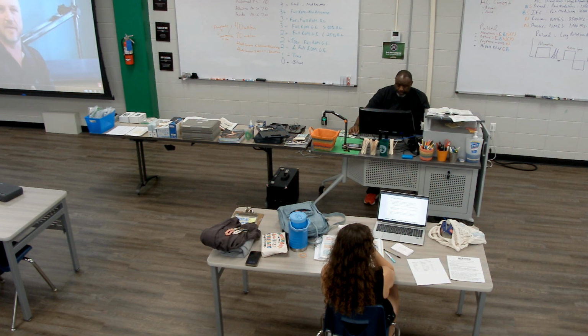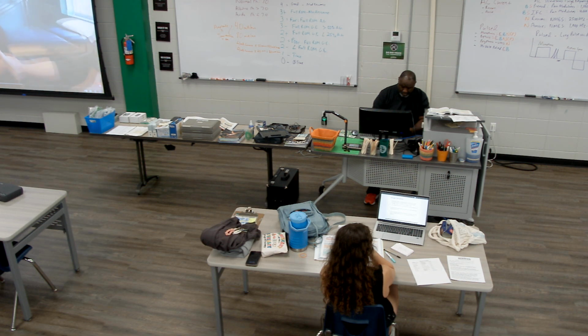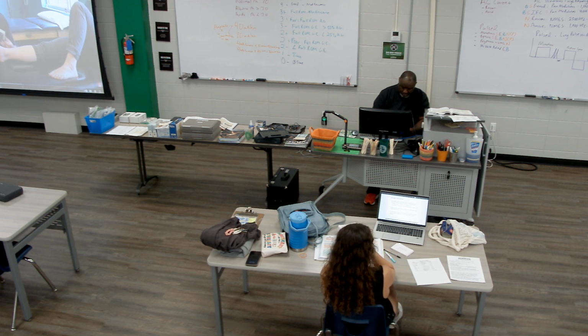All right, so here today we're talking about iontophoresis, and basically what iontophoresis is to help reduce inflammation and pain. It also helps with major diagnoses that we see here in biomechanical therapy, such as fasciitis, bursitis, tendonitis. It also helps with osteoarthritis and rheumatoid arthritis to decrease the pain and inflammation in the joint. So we have two methods of iontophoresis that we use here. One is by using this device here, and when we use this device, it takes about 20 minutes.